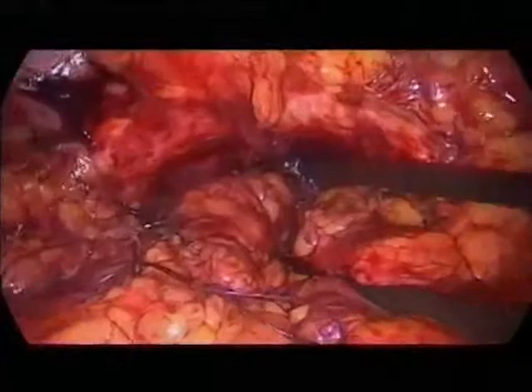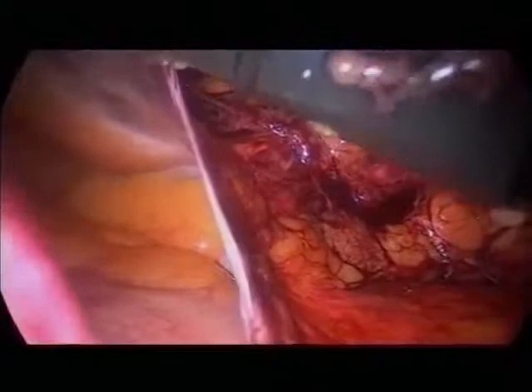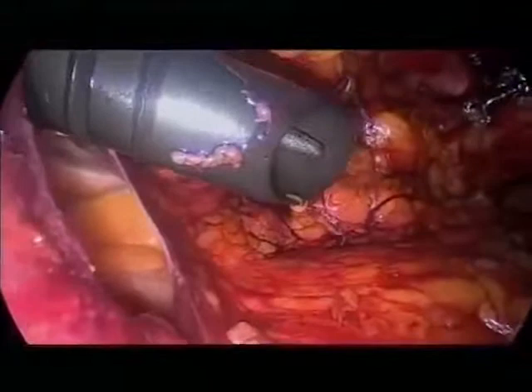One thing I would like to show. So this is a little bit like the old Marshall-Marchetti. Can you see that? We have a little hole in the peritoneum. A little hole. But you see, there's no problem with the space.